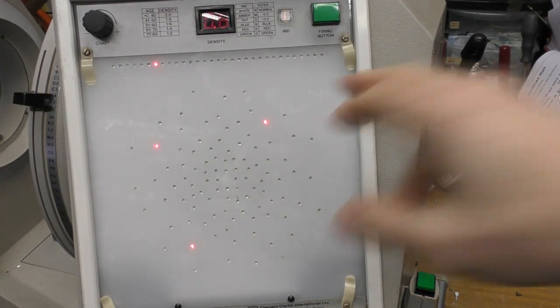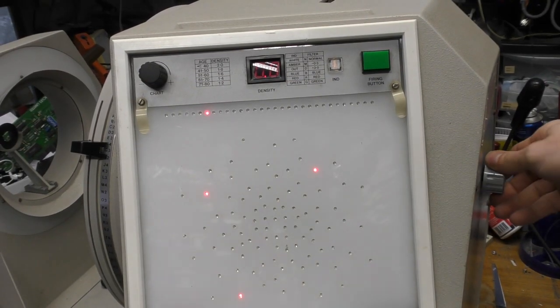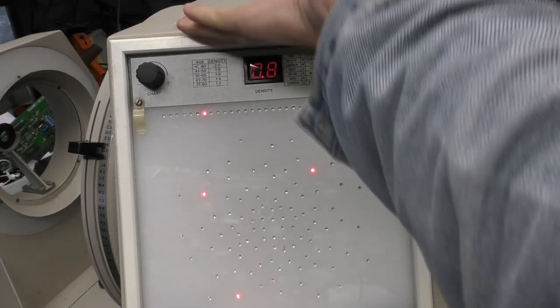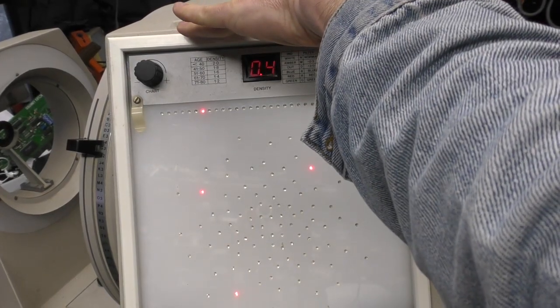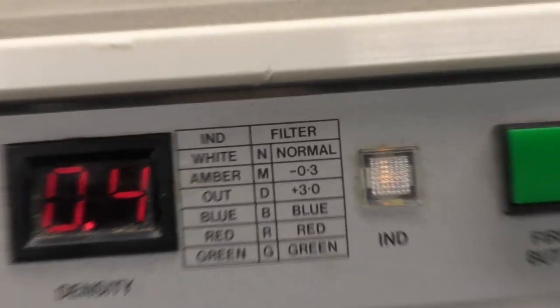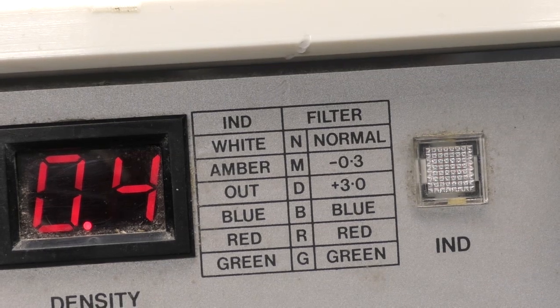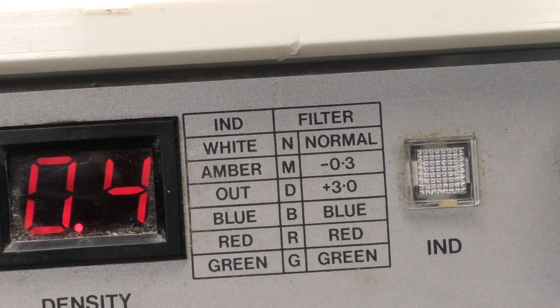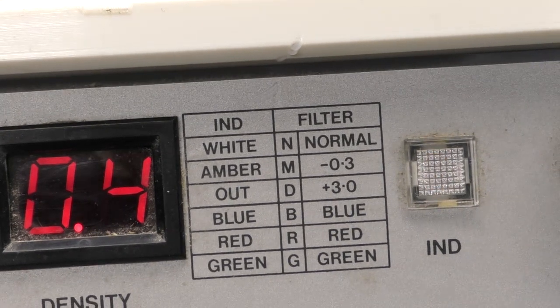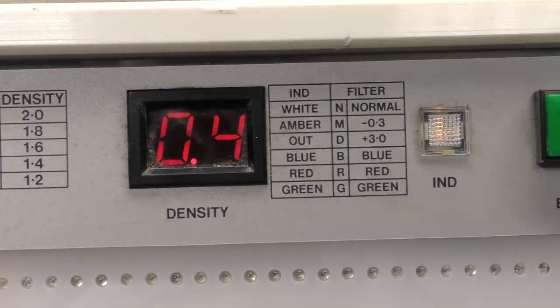There's an indicator here for density. There's a control on the back which just controls the intensity of the light, and it shows that on a 7-segment display. And there's a wheel on the top that selects various colour filters, and this indicator here shows which filters have got white, green, red, blue, and there's an orangey one somewhere. And these letters correspond to numbers written on the top of the wheel.